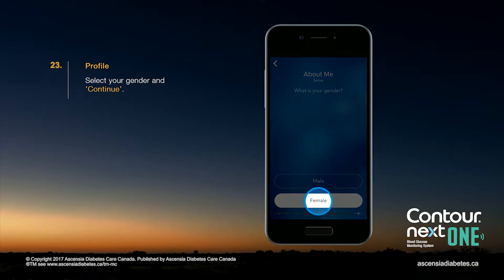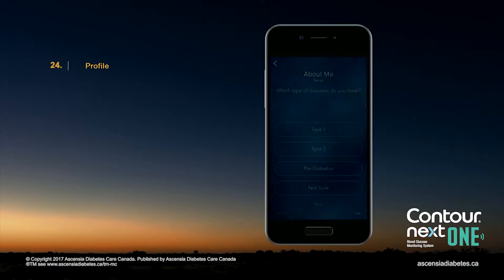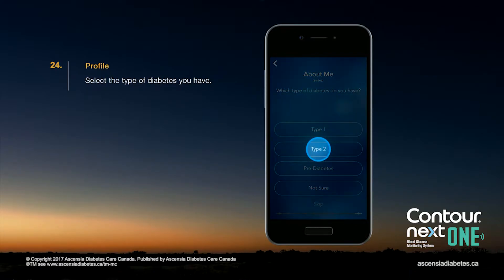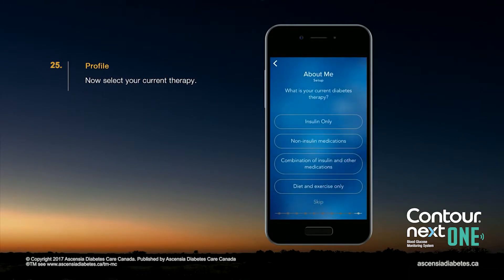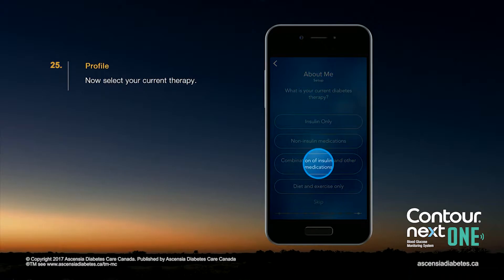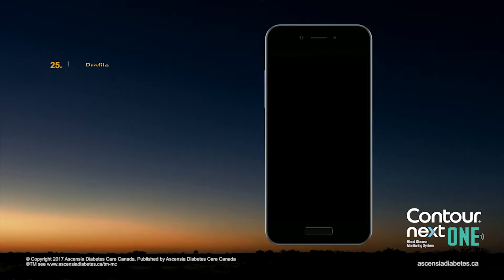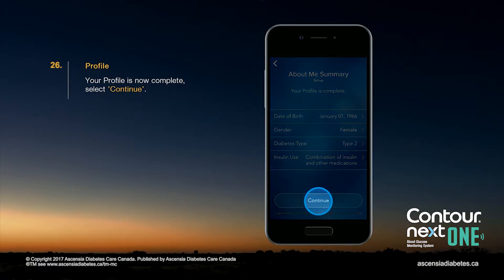Select your gender and continue. Select the type of diabetes you have. Now select your current therapy. Your profile is now complete. Select Continue.